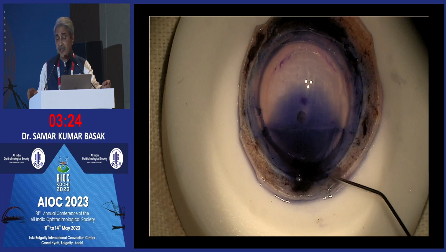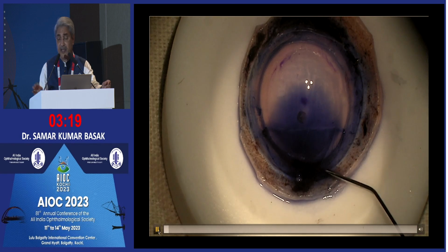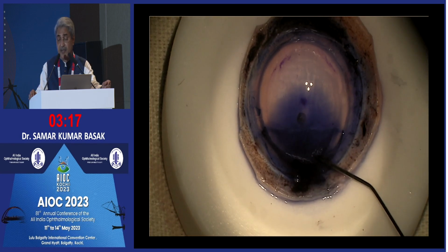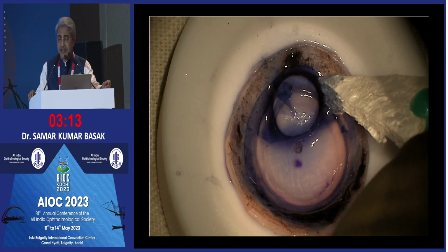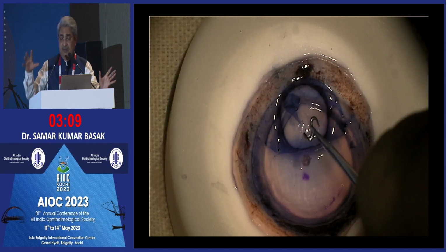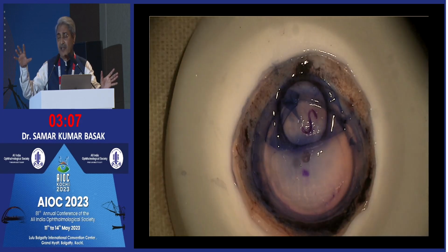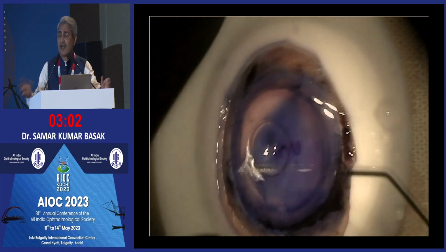This is a thing I learned from Rajesh. This is also another way of stamping: you put a bubble and write, again put an S. So you have more than 8.5 or 9 millimeter, and you put an S mark, then you do the punching.